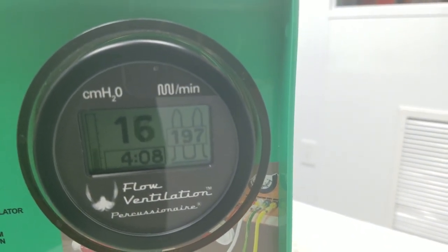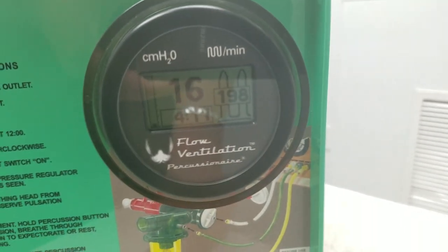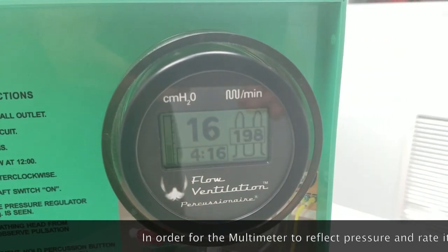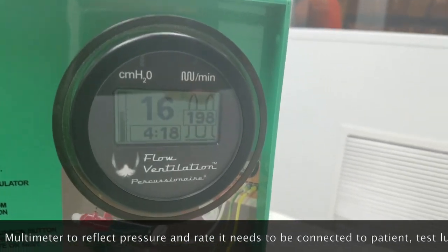We should get an average number of around 200, somewhere between 200 to 220 possibly. Just about 198 — so we're right there. MAP is 16.